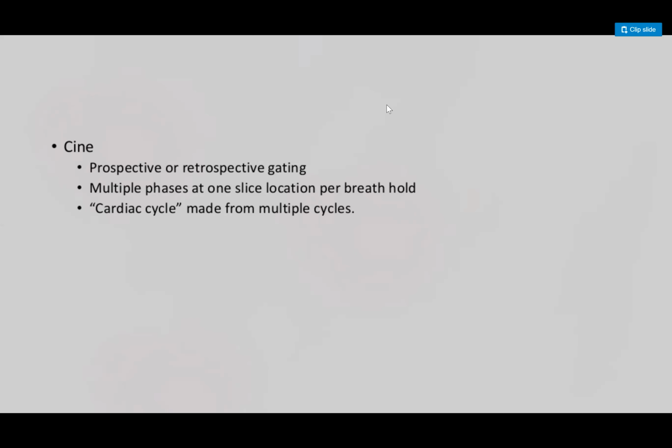If the echo time of every pulse is long, as in T2, it will distort the image a bit. So that's why we don't do it, but yes, you can change it to get it. We don't really use it.